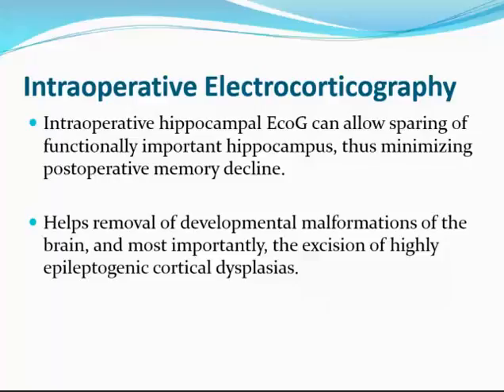Our job as neurophysiologists is to go in there and help the surgeon demarcate functional brain, as well as find out exactly where the area that is causing the seizures is coming from, and the demarcations, so we can take out what needs to be taken out and leave what needs to be left in there.